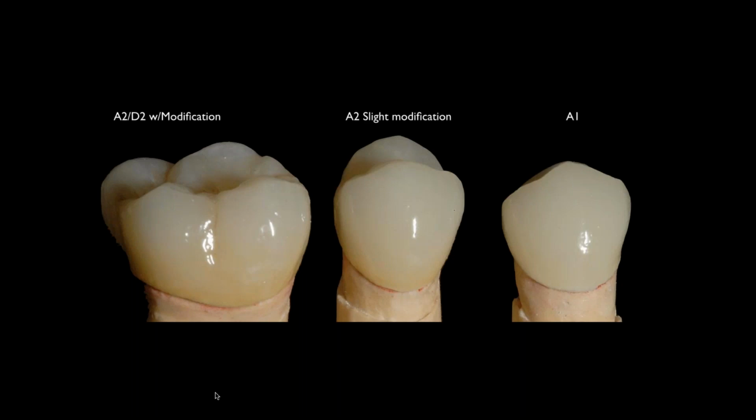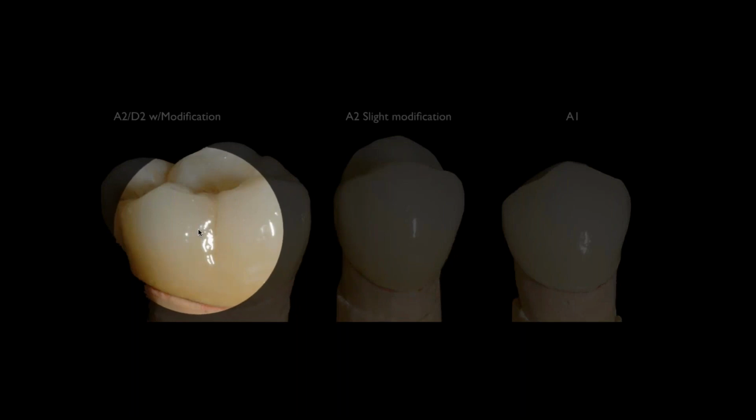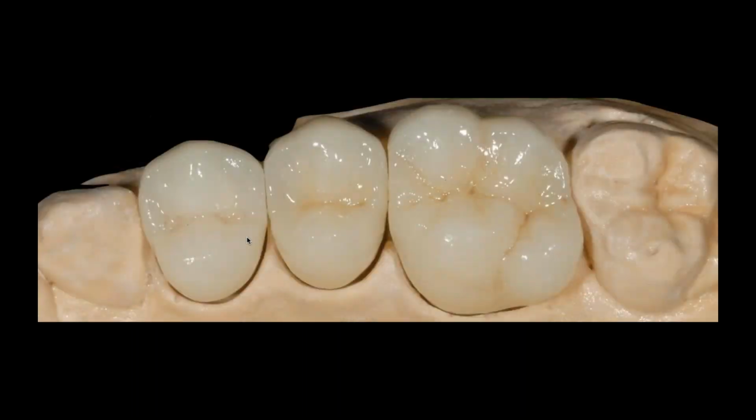So there was no color in the actual material that I'm going to put over those copings. But I want you to notice the difference when I put the same material over all 3, how much different they look. And the reason they look different is basically because there's different coloration inside, which means the light is passing through the material and hitting whatever that substructure is, your natural tooth, whatever opaque or liner material that you put on there is really what's giving you way more color than you realize.